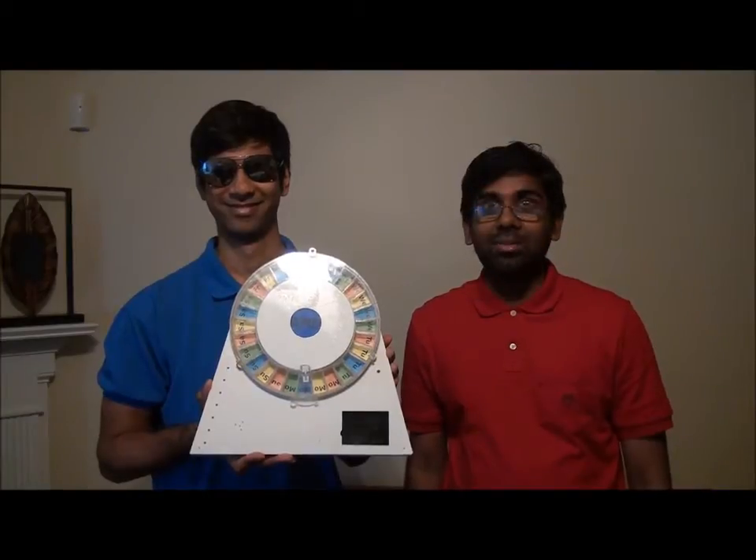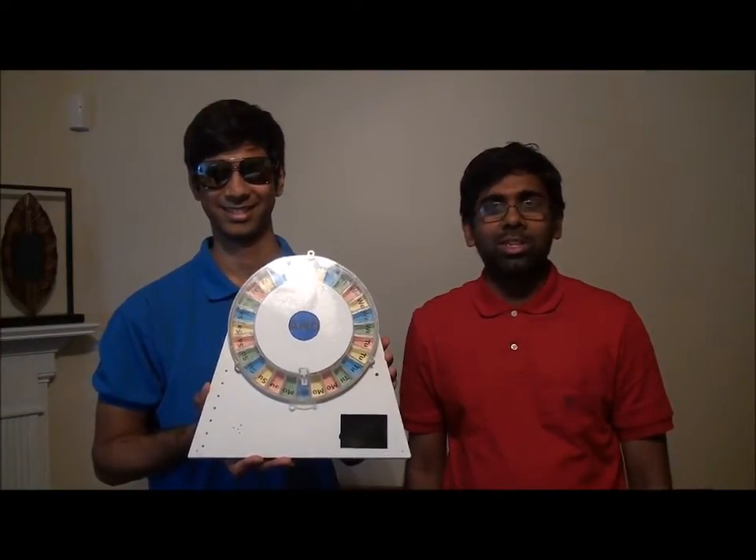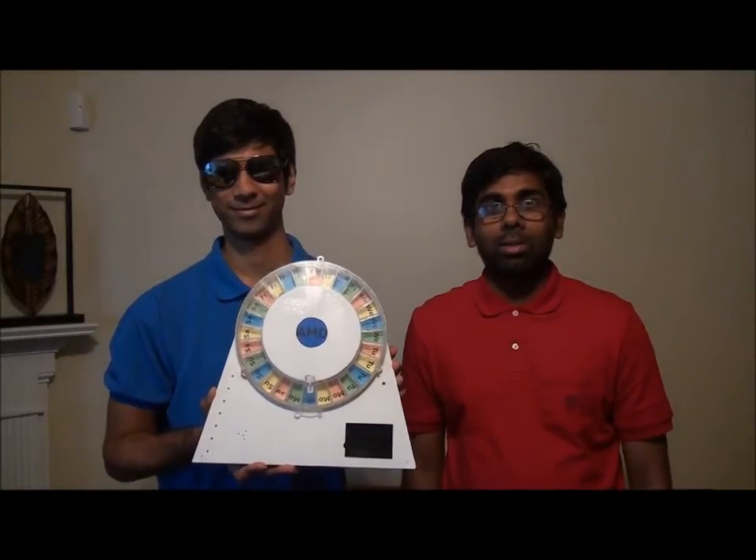Hi, this is Suvrat J and this is my partner Vinay Reddy. We are both students at the College of Electrical and Computer Engineering at Georgia Tech and we will be giving you a quick tour of the automatic medication dispenser. This product will alarm when it's time to take your medication and track whether or not you have taken it. As you can see here, it holds enough medication to last for one week while dispensing four times a day.